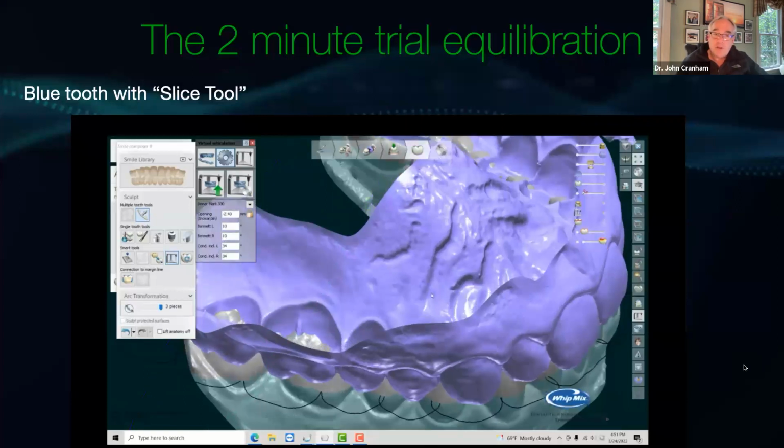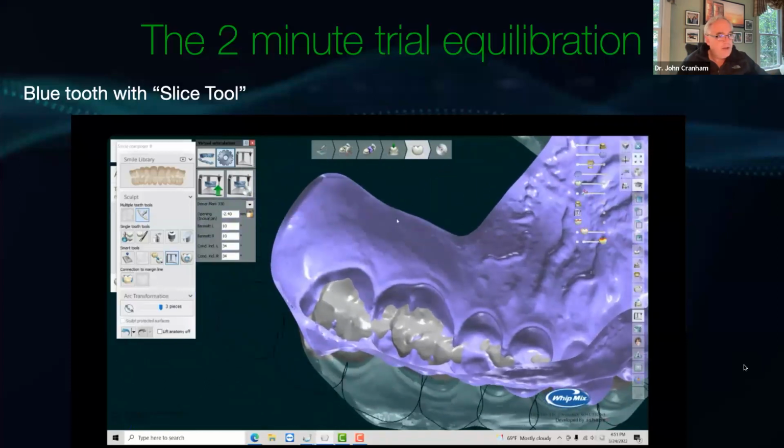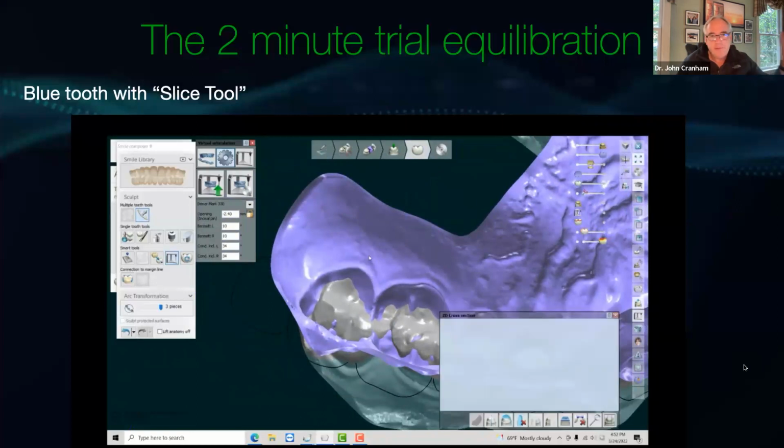Now, if you're learning to equilibrate, I don't think this is enough. With, like, my daughter, when she's at that point, what we'll do is mount these models. We'll print these models with little mounting jigs or mounting points, which is easy to do through Model Builder. And then she can do her trial equilibration to gain the skills of learning how to equilibrate. Because equilibrating this, while we can do it, it's just not the same tactile.